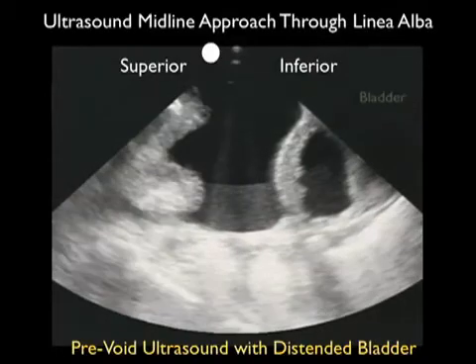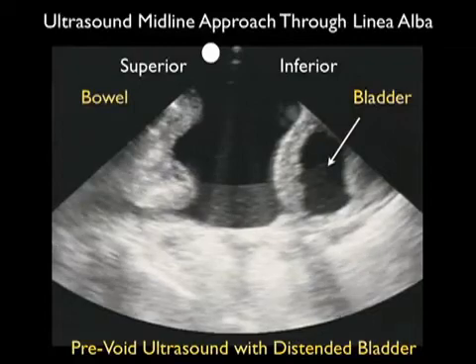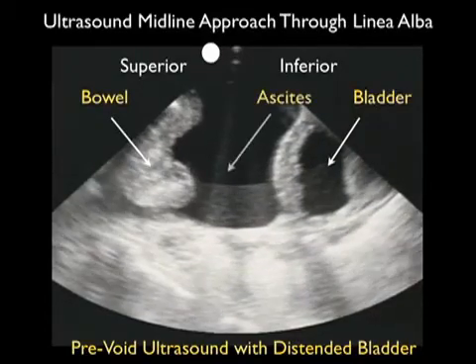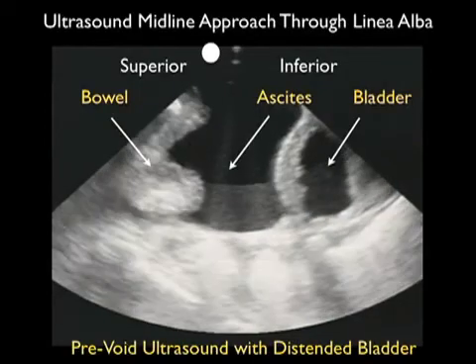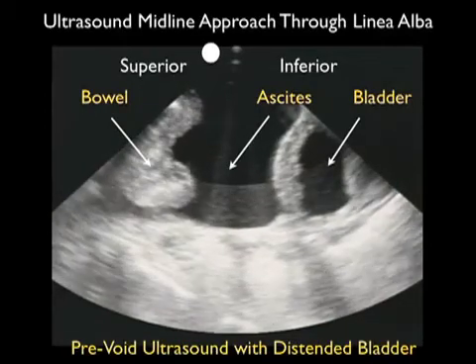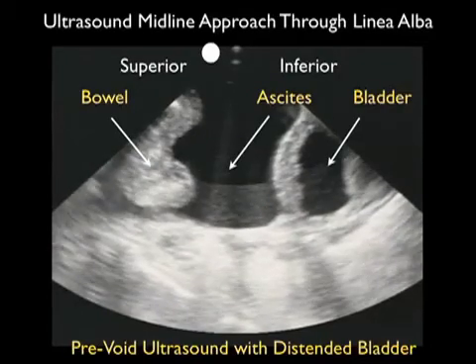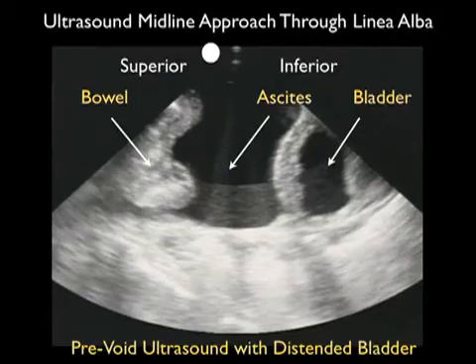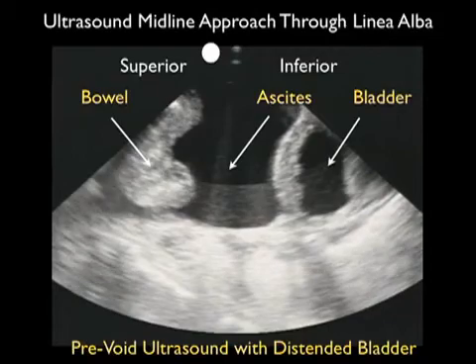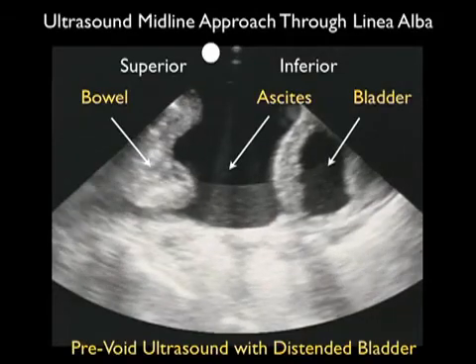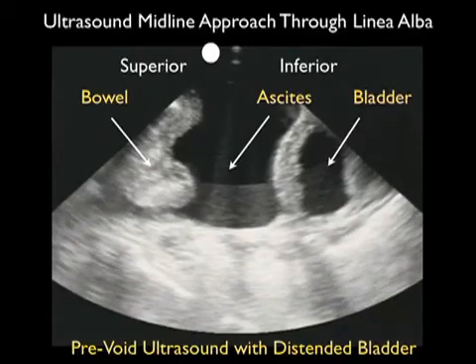Here is a video clip from the midline linea alba taken with a 3 MHz probe. The probe is oriented towards the patient's head, so superior is towards the left and inferior towards the right. We see the bowel superiorly moving up and down within the ascites fluid in the middle of the image, and note the bladder, relatively large, towards the inferior aspect of the image. This pocket is amenable to paracentesis, but to increase safety from the midline linea alba approach we'd want to drain the bladder prior to a puncture attempt.